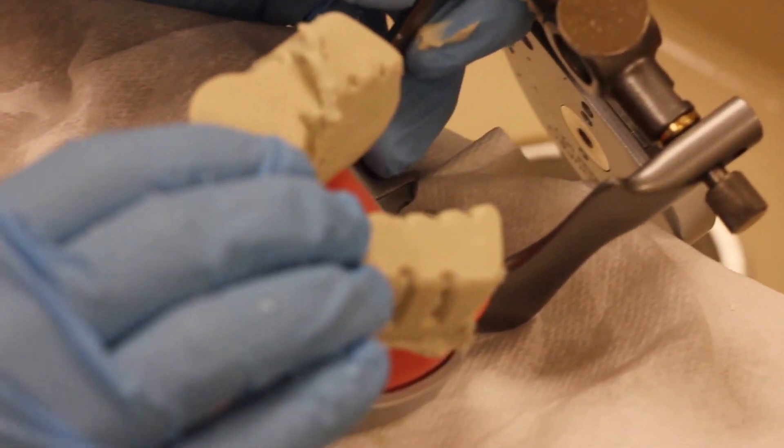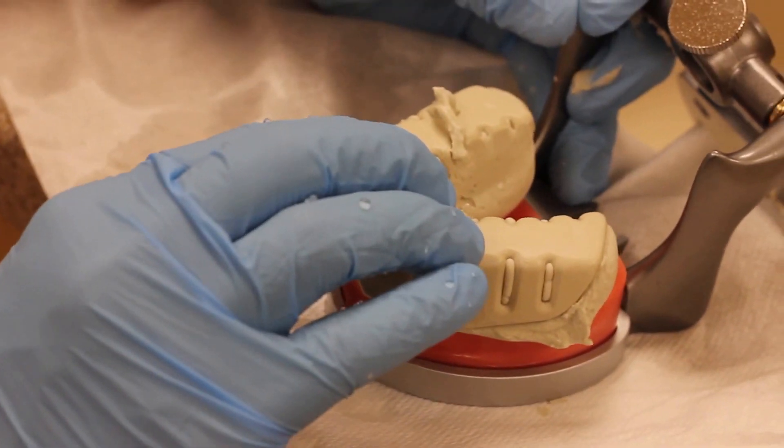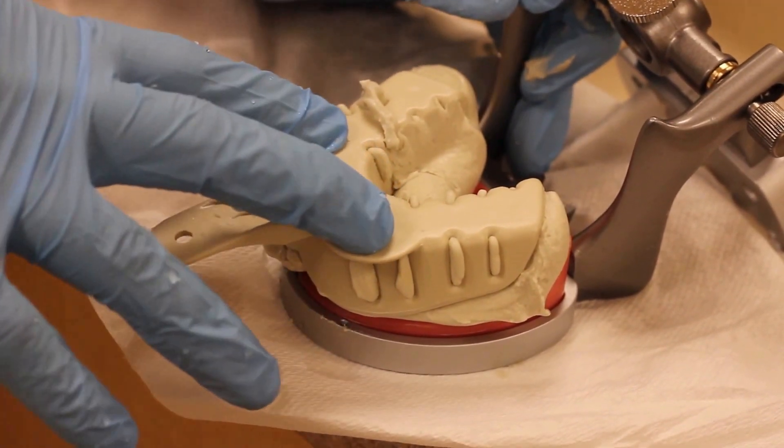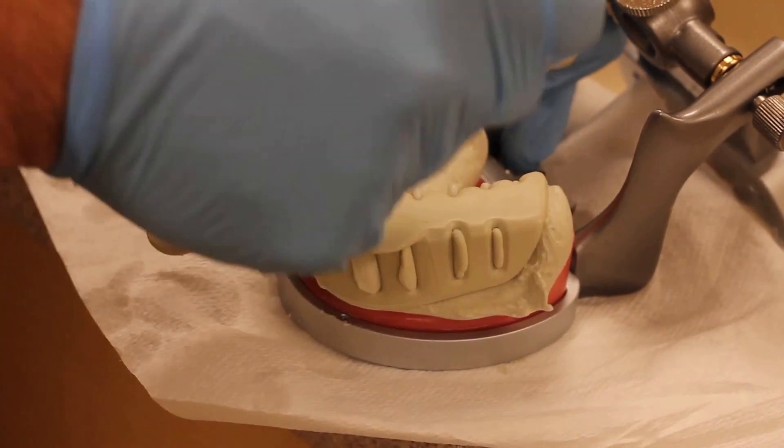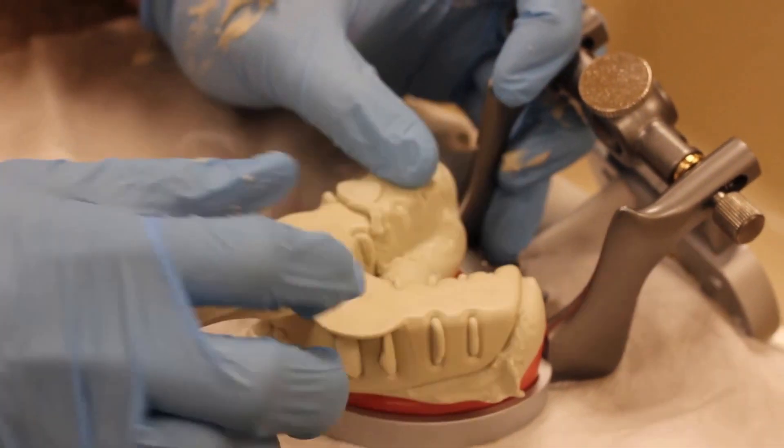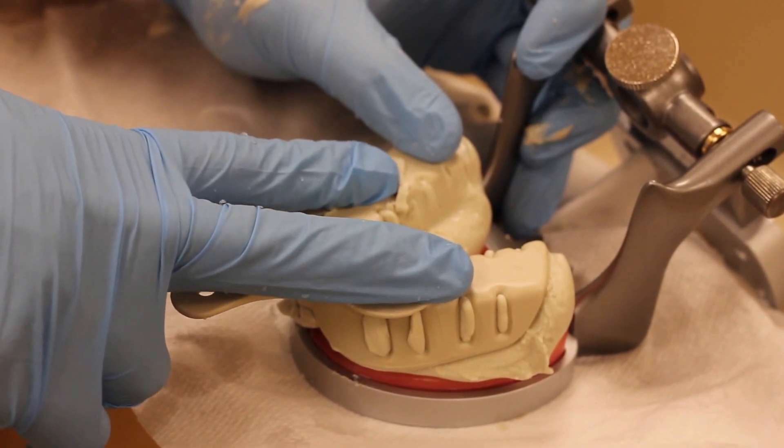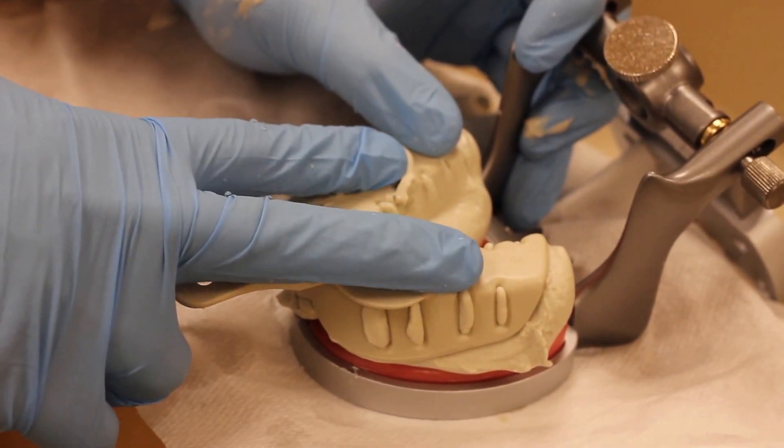And as I go seat I'll retract the lips with my finger and then also the other side with the tray. Give it a little wiggle as I go down. And if this is a patient's mouth I'd do a little border molding movement. But I'm really paying attention to make sure that the tray doesn't shift a lot.